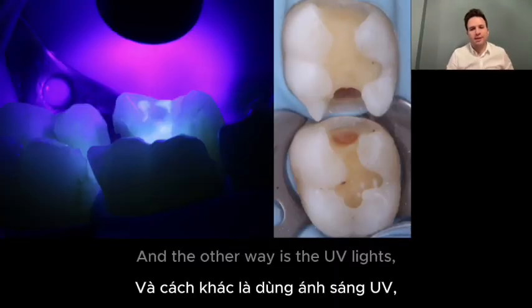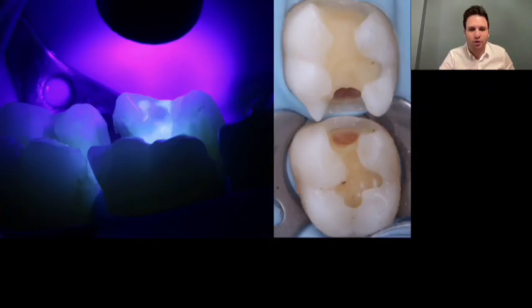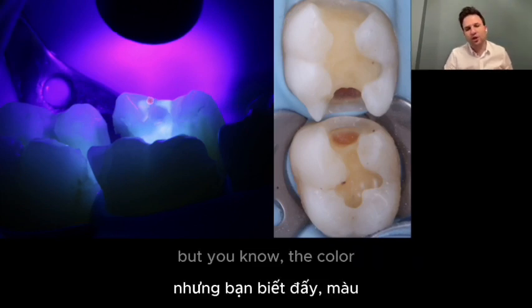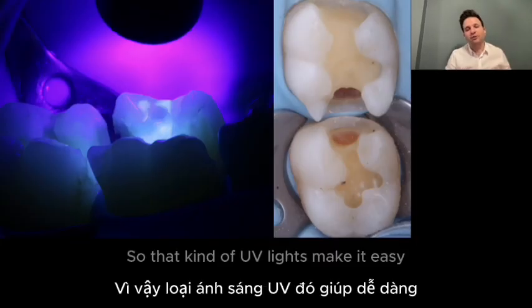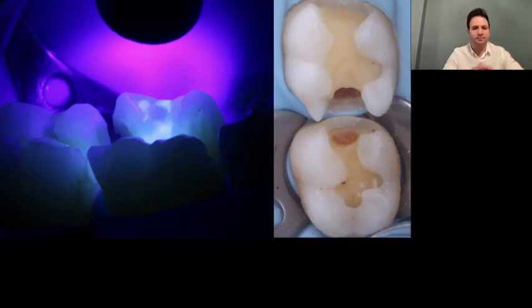And the other way is the UV lights, especially when you are removing the old restorations. UV lights may show the former restoration's remainings. For example, I cleaned the old restoration, but the color of the composite is almost the same as the natural tooth. So UV light makes it easy to see the remaining old restorations.